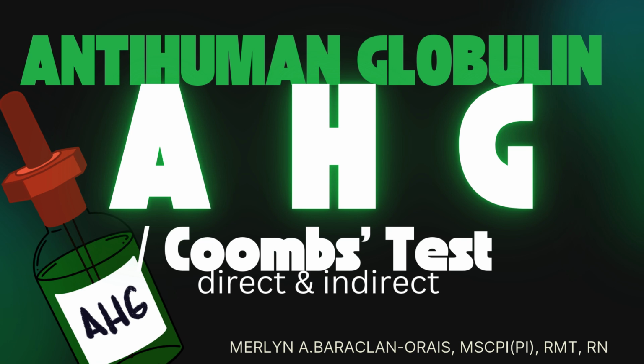Conversely, the indirect test detects free-floating antibodies in the bloodstream that may interact with red cells. This test is crucial for prenatal screening and ensuring compatibility for blood transfusion. Grasping the significance of these tests is instrumental in effectively identifying and managing the range of blood-related disorders.